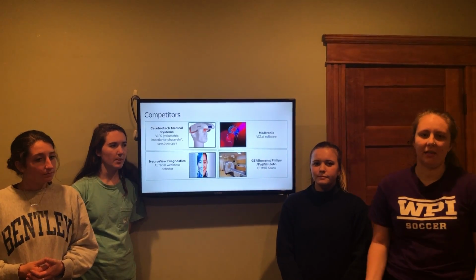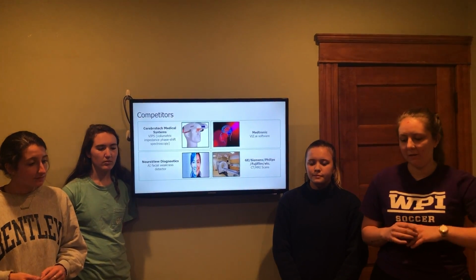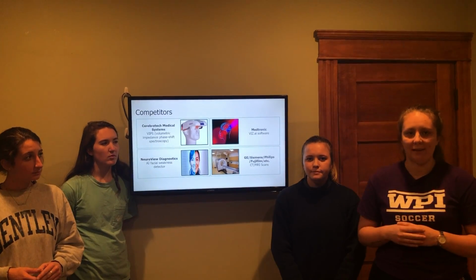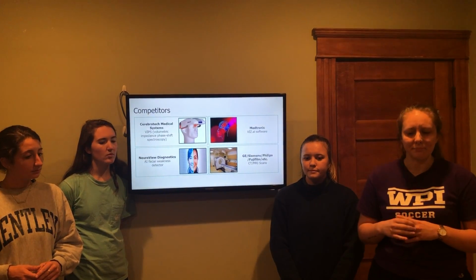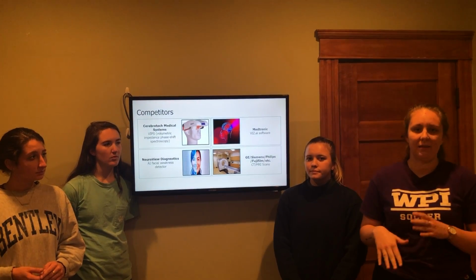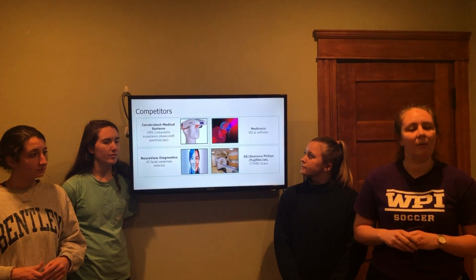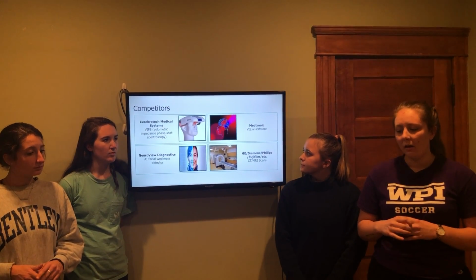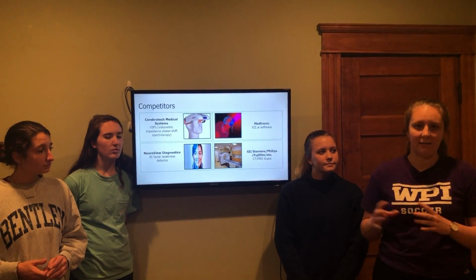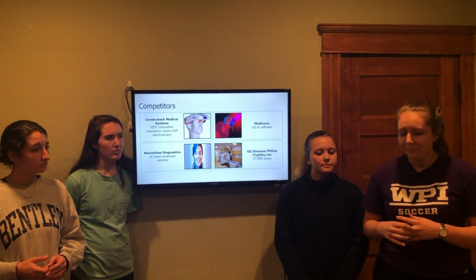So though our device is unlike any currently on the market, we have identified some competitors. The first being Cerebrotech Medical Systems, and they have a visor headgear type device called VIPS that detects stroke and is used by emergency responders and people in hospitals. Medtronic has a software that they're currently marketing called Viz.ai that uses artificial intelligence to detect stroke and send the images to the hospital workers.